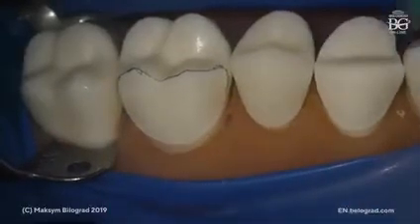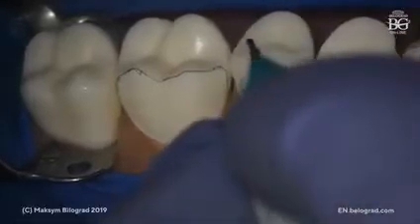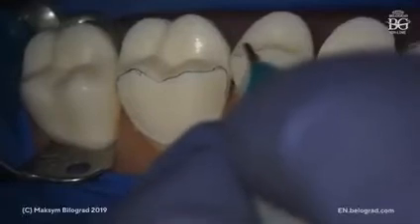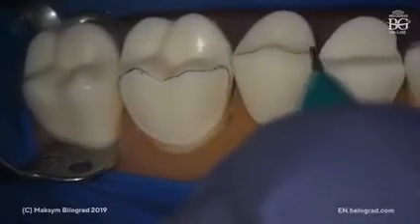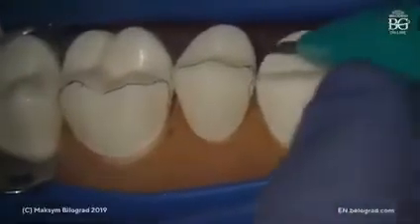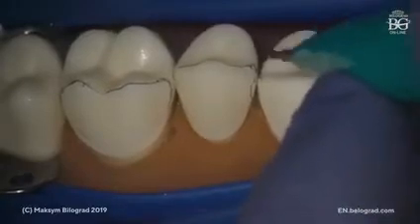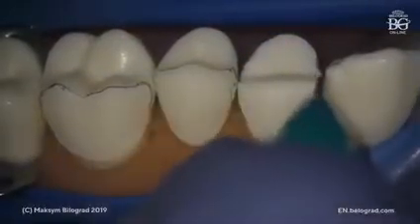That will be for the dental technician. Here you will have this thing which is sharp. Okay, here. And for this premolar, the first one, this is the finish line for your dental technician. I mean, this outline is the finish line for the dental tech.